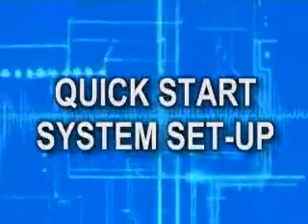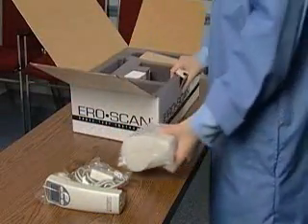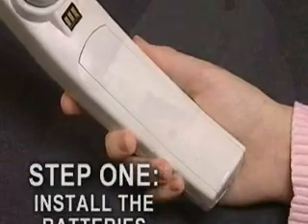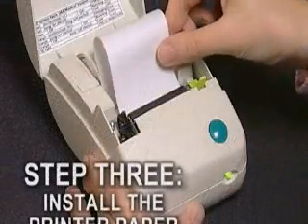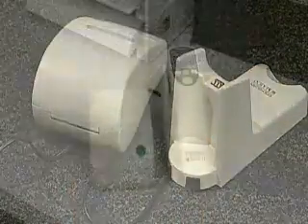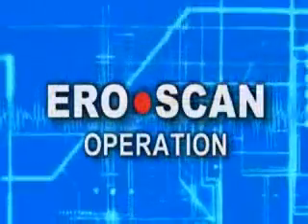To get you up and running quickly, let's cover the Quick Start system setup. When the system first arrives, a minimum amount of setup is needed to make the AeroScan operational. We can complete this in four easy steps: Step 1, install the batteries; Step 2, connect the power supply to a wall outlet and the printer; Step 3, load the thermal paper roll into the printer; and Step 4, connect the printer to the cradle. The setup is now complete. A detailed setup section will be covered at the end of this video.